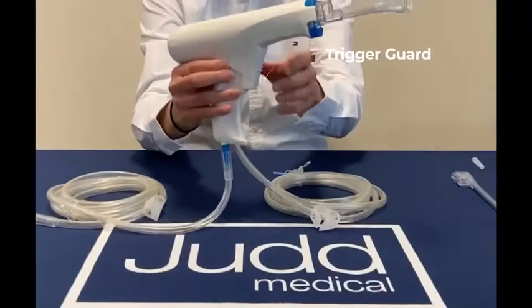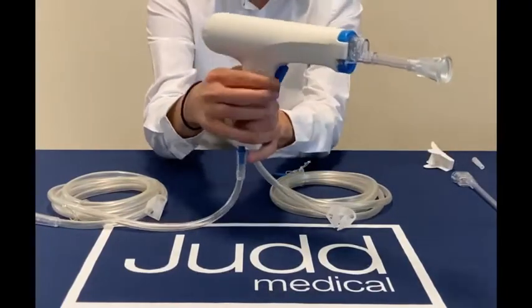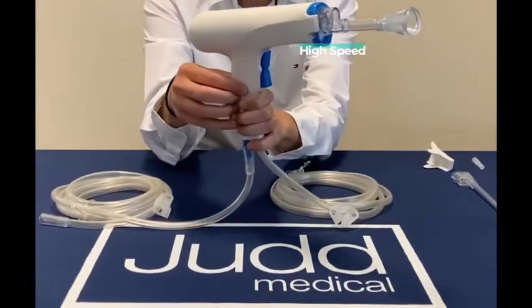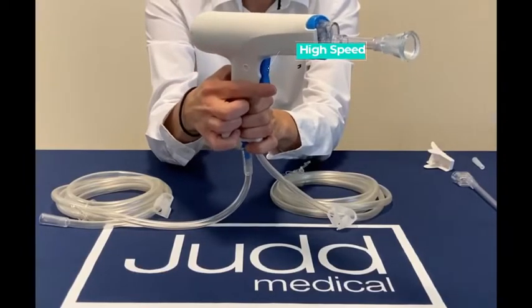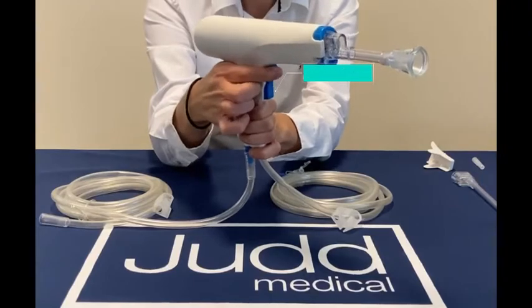By removing and discarding the plastic trigger guard from the toggle trigger, the system is ready to operate. Depress the top of the trigger for high speed fluid delivery and the bottom of the trigger for low speed fluid delivery. To stop the unit, ensure the trigger is in a neutral position.